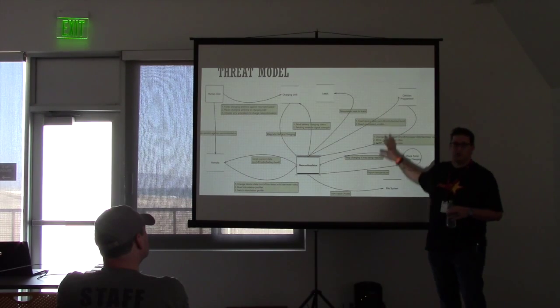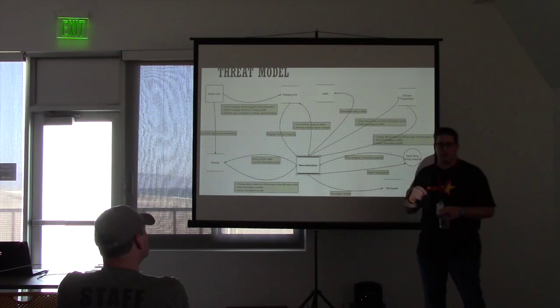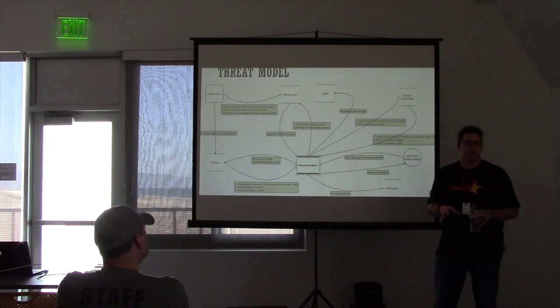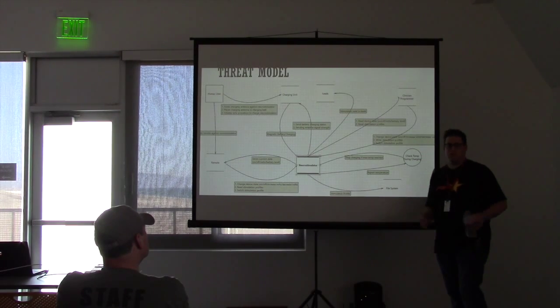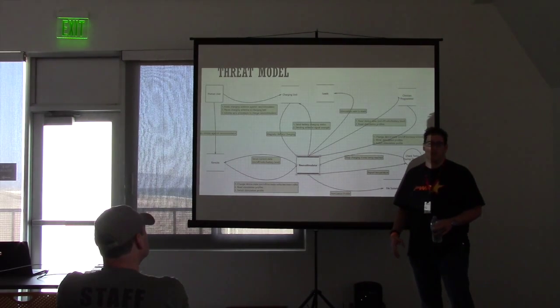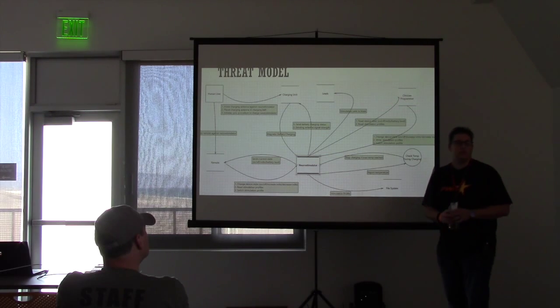That gets adhered to the spine in different areas, and depending on where the pain program is turned on, it hits different areas of the branch of nerves. So if it's programmed wrong and the damage for my wife is in the left foot, she felt it in her right foot, or she felt it in her right hip, or in her knee and her left leg. So it can control stimulation basically from the waist down to get to the right level so that it's trying to hit the place where CRPS is.